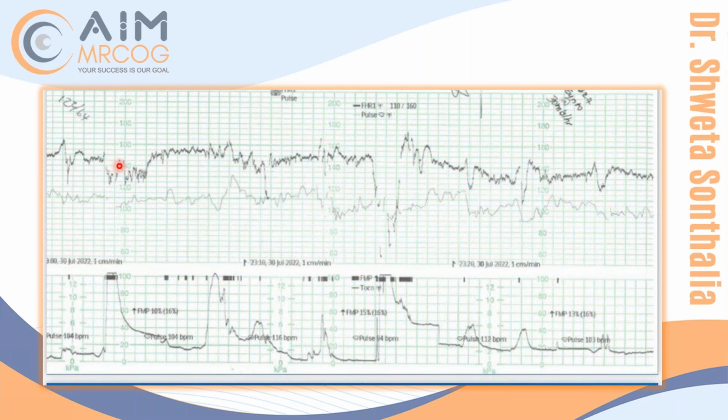And as I told you, baseline is not a very important thing. You should understand where the baseline is so that you can understand whether it is acceleration or deceleration. You were right saying it is somewhere around 150. If you see here, it is around 145. Then here it becomes 150, then again 150, then 150. Then here it is dropping to 140, the baseline. Again, here it is 130. It doesn't matter much as long as it is lying between 160 and 110. So baseline is all right. I'm not worried about baseline.